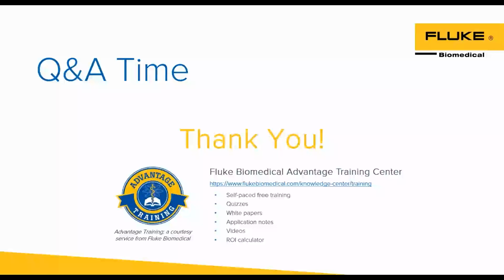Great, thank you, Elliot. There's one more question here. How do I test dual channel pacemakers with the Impulse 7000? Well, I'll grab that one. That's a great question, I get that one a lot. The unfortunate answer is you can't. Dual channel pacemakers require a different analyzer. The Impulse 7000 is only built to do single channel. While people try to adapt it over, it's not going to work right for you. So you really do need to get a separate analyzer for dual channel pacemakers, for sure.